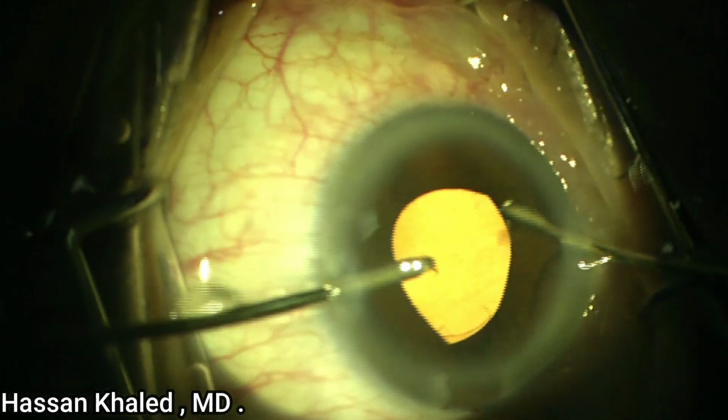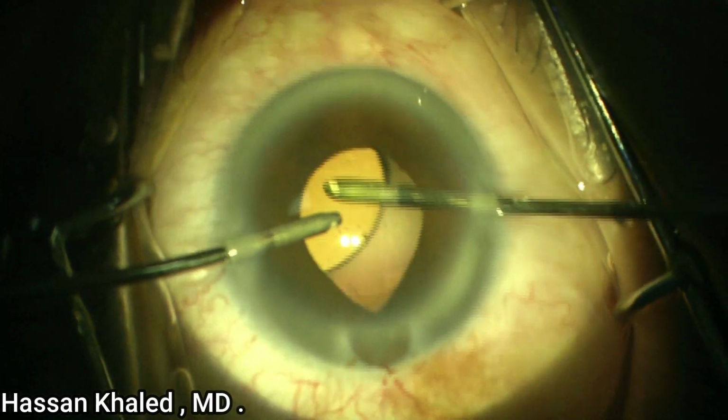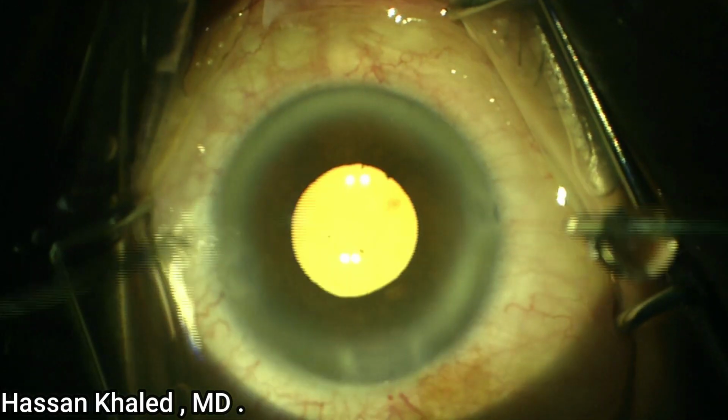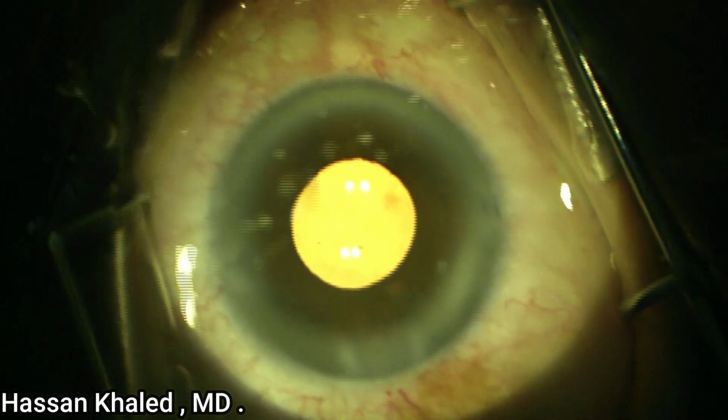Here is removing the OVD behind the IOL. Now you can see the surgery went beautifully without any complication. You can see a clear cornea by the end of the surgery.